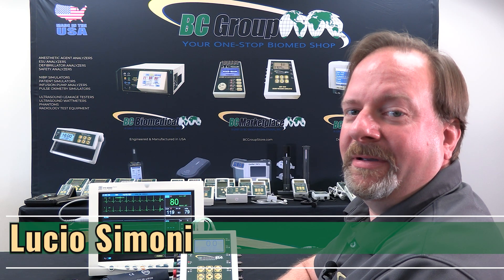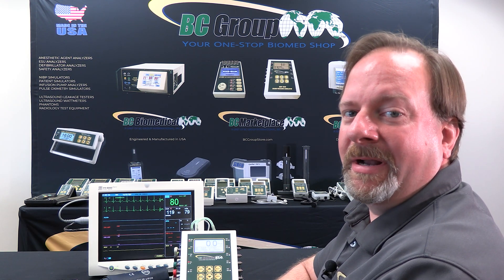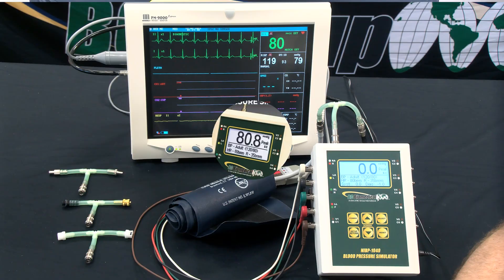Hi, my name is Lucio Simone, I'm the engineering manager for BC Group, and in this video we'll be demonstrating ECG simulation using an NIVP series 1040.